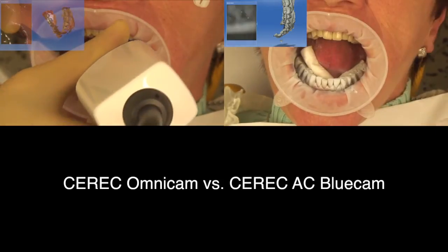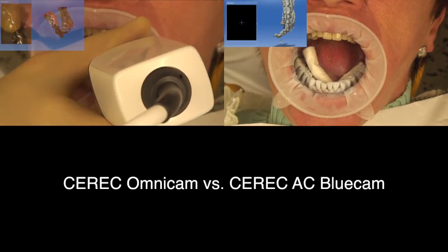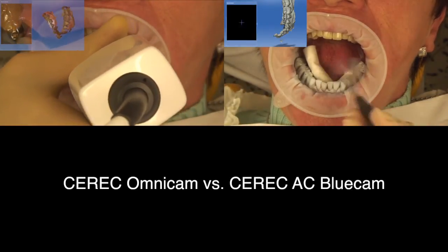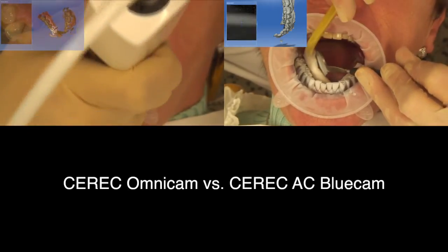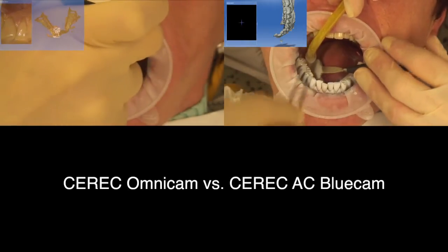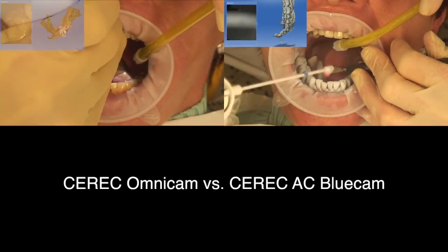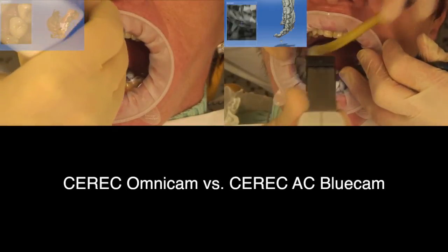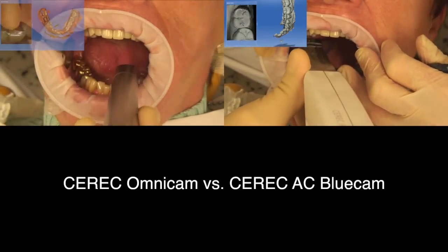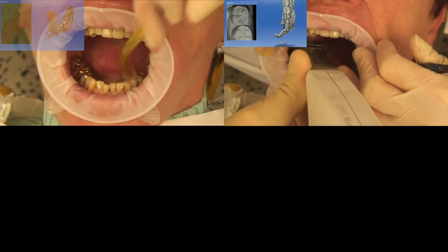With both options, any unwanted artifacts can be removed, even in the scanning phase. With the Bluecam, any images with the artifact or any images that are blurred can be removed by opening up the catalogue and then deleting the image. With the Omnicam, the specific area can be circled around, cut out and then re-scanned in the 3D model.